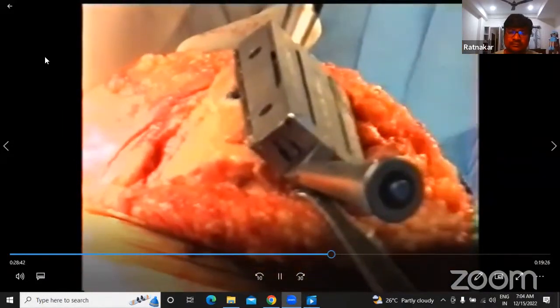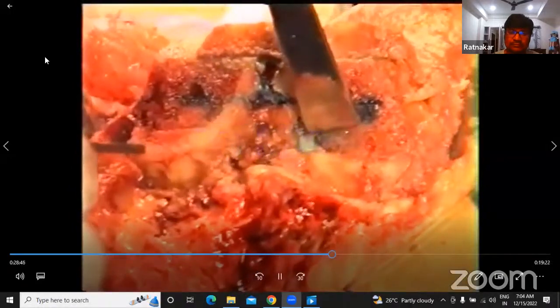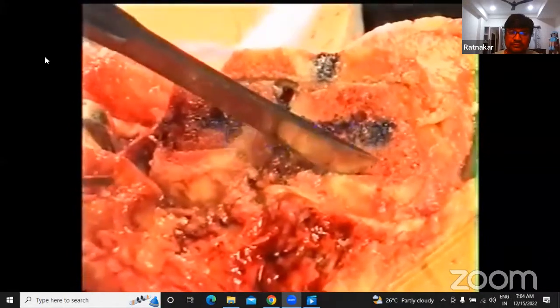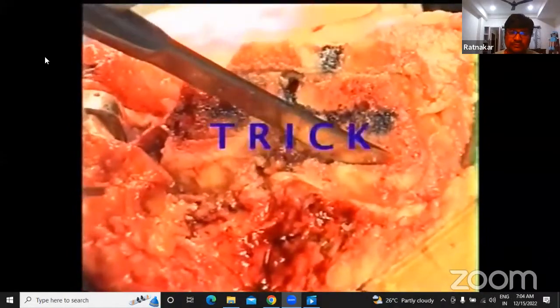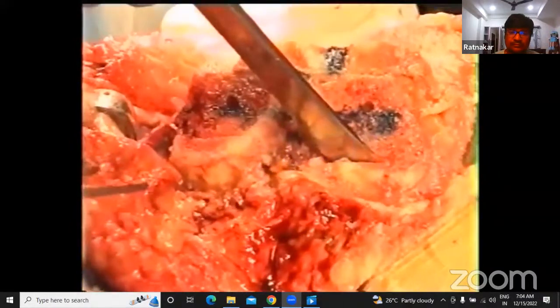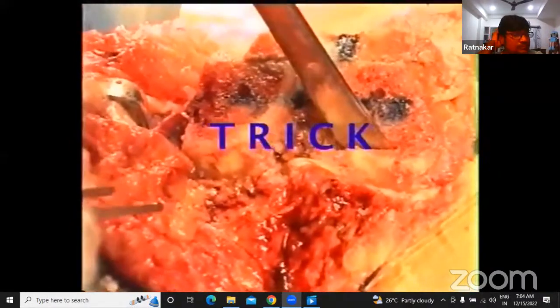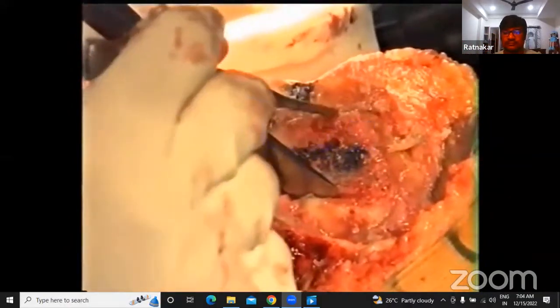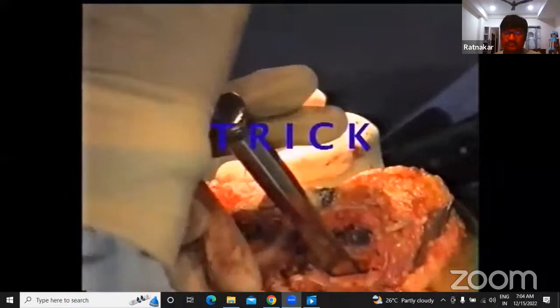Now I'm going for the posterior chamfer. That is our chamfer cut. And that is our posterior cut. You should always go there and try to take this out, so that when you lever that out, this chamfer will prevent you from damaging the distal femur.